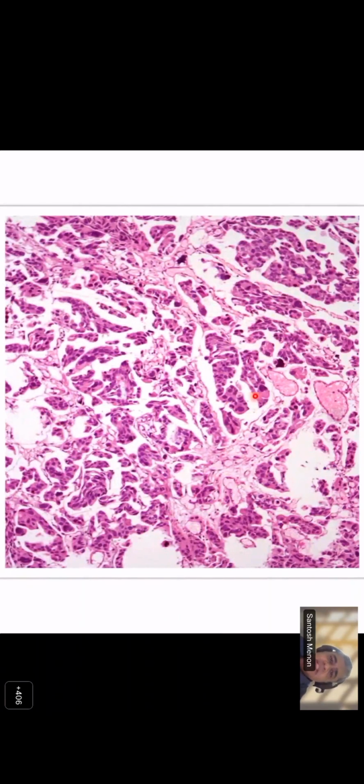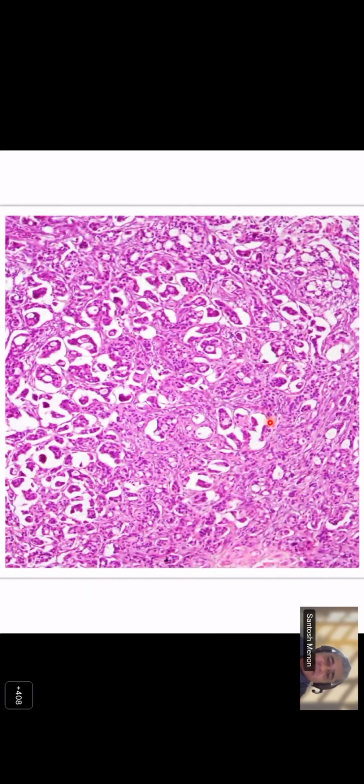Sometimes you may have multinucleated giant cells which start looking almost like a trophoblastic appearance, and if you employ beta HCG, you may find that these are beta HCG positive, and that's a different kind of subtype which is called a trophoblastic subtype. This is the ring form.